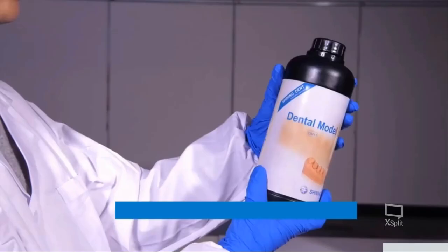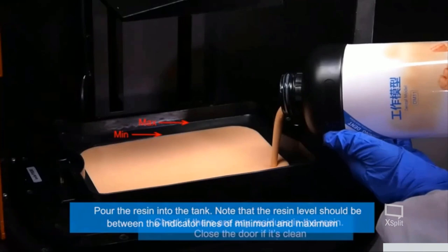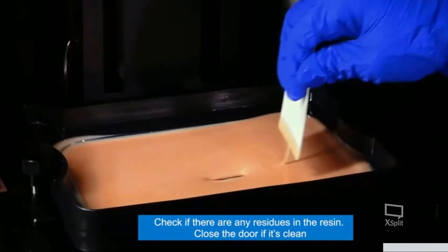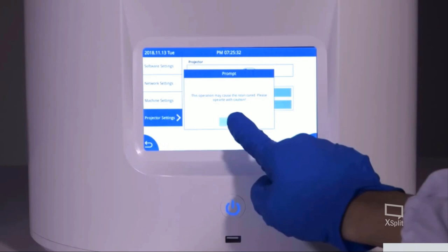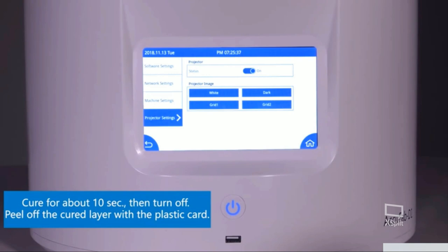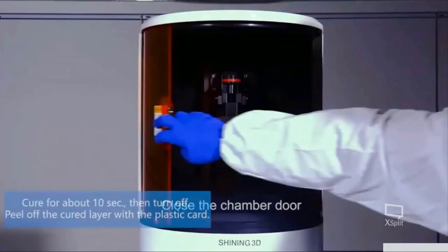Another important step in order to print correctly is to mix the resin for 2 minutes or more before putting the resin inside the vat, inside the resin tank. If you are printing for the third or the fourth time with the same vat and the same resin inside, it is necessary to mix the resin with the card. It's necessary to mix the resin very well with the card, otherwise the different layers will not be in contact. I mean, you will obtain defects in the model.